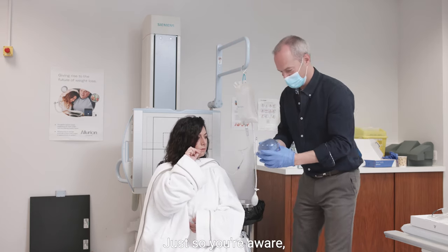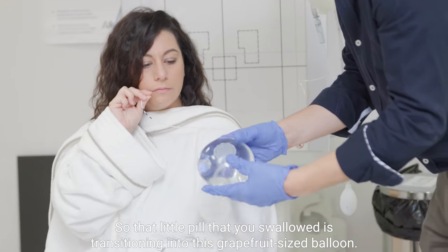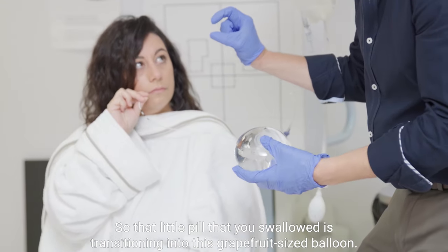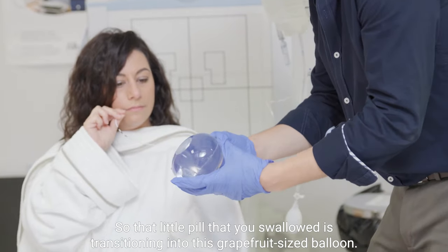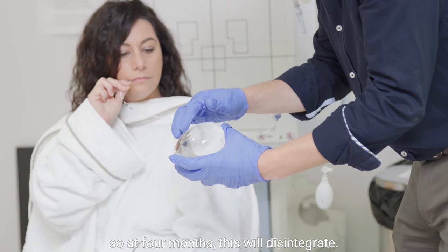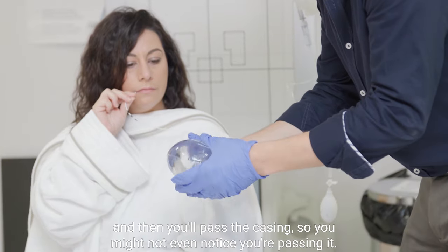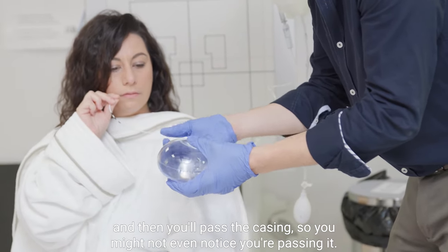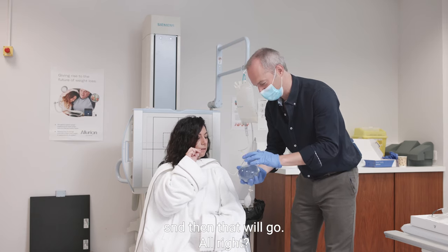Just so you're aware — we did discuss this at your consultation — this is the balloon. That little pill that you swallowed is transitioning into this grapefruit-sized balloon. This thing here is the release valve. So at four months, this will disintegrate, the balloon will just empty, and then you'll pass the casing — you might not even notice. Sixteen weeks and then that will go.